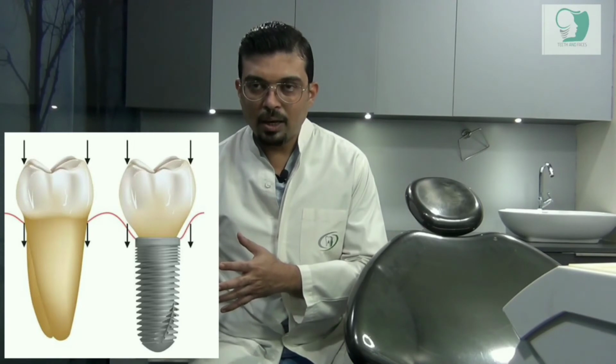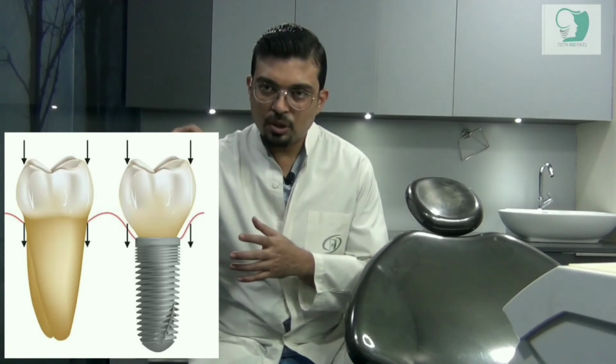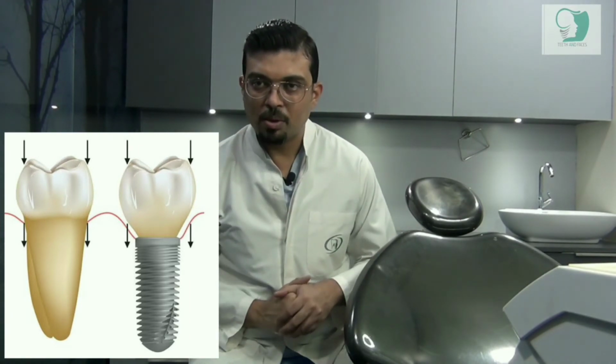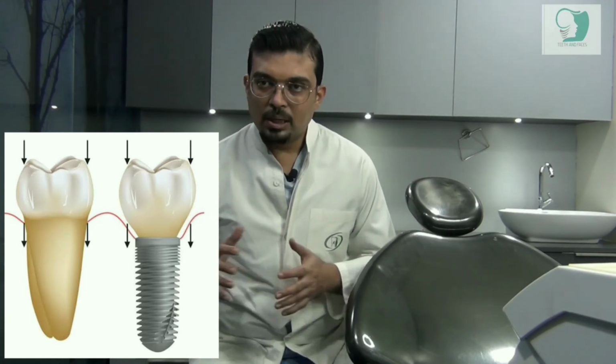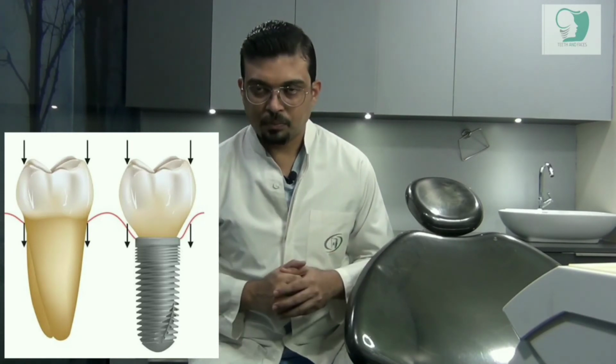A dental implant, on the other hand, has the same thing: a crown part, the artificial tooth now, which replaces the tooth that was there in your mouth, and a root part, which is the cylinder with the thread which has gone inside the bone. It replaces the natural tooth root.